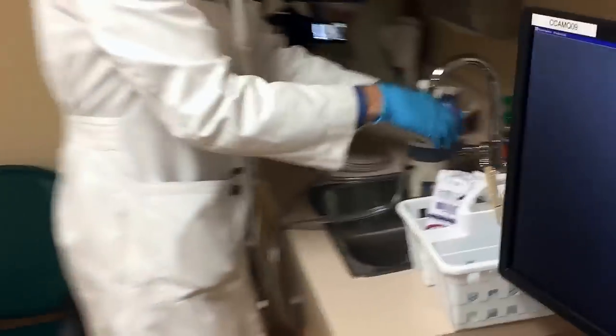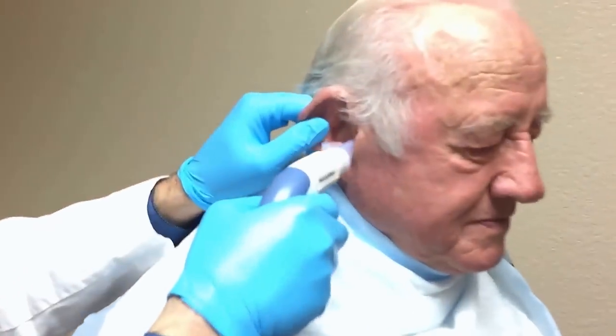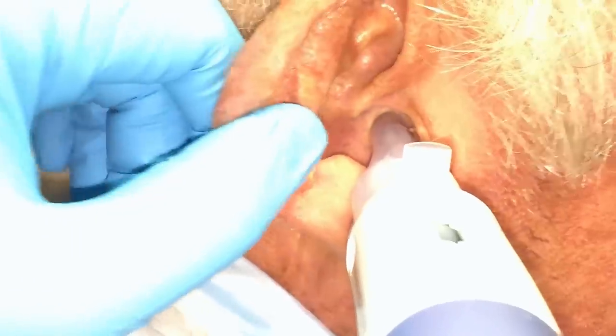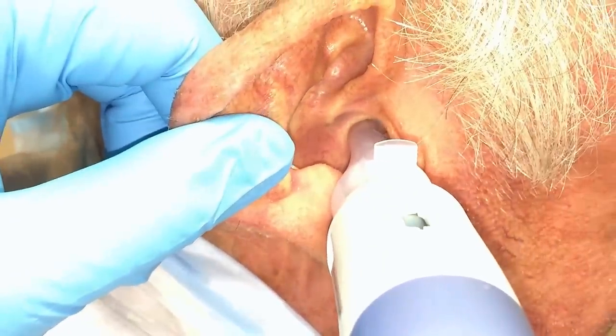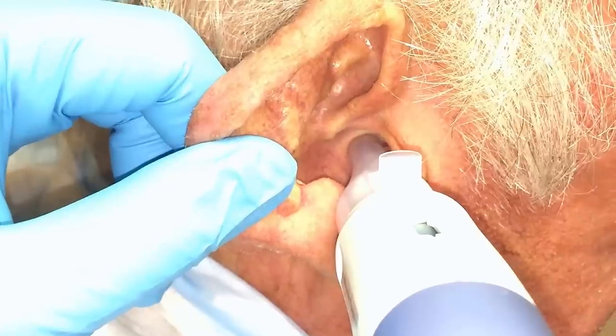It's not that bad. So this is your right ear that we're delving into right now. What we see is a little bit of wax on the outside and a lot of wax deep in. Let's get this going with the right temperature. We'll start.